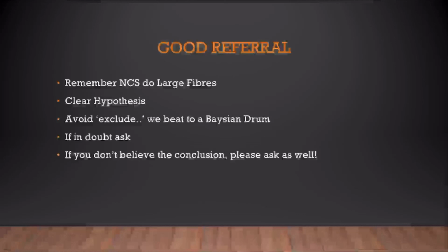Sometimes things do change. We are a clinical specialty, much the same as you're a clinical specialty, and the nerve conductions and EMG usually precede the clinical picture, and can be a really useful early warning tool, but sometimes they can also be similarly confused as various processes at a molecular level take place.